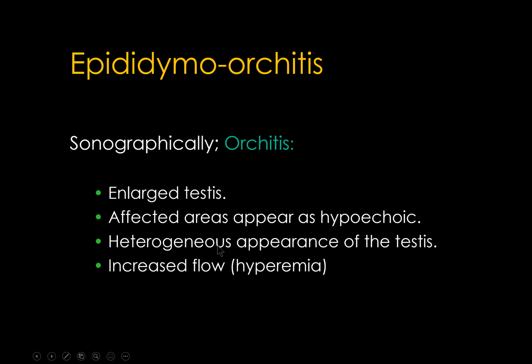If the infection spreads into the testis, it will cause the testis to appear enlarged or swollen. Because of the edematous tissue, the contents are more fluid, so it will appear hypoechoic compared with the surrounding tissue. This will result in a heterogeneous appearance of the testis. On color Doppler, there is increased blood flow, or hyperemia.